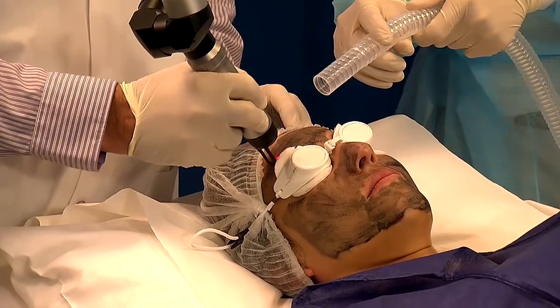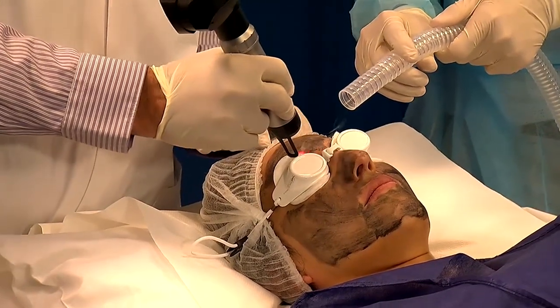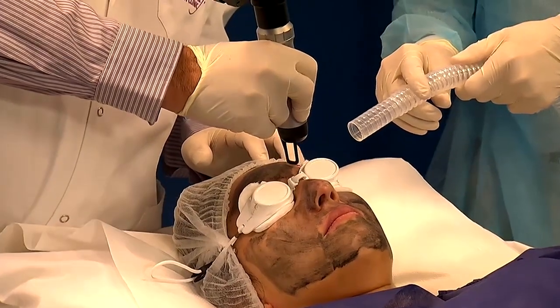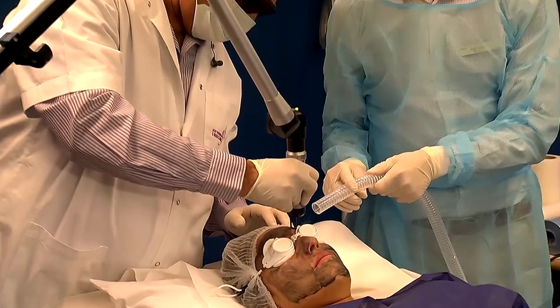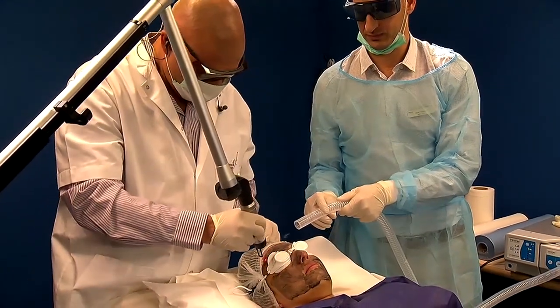After that, we have a drier layer, and then the skin will be removed faster and easier. It's a procedure that doesn't cause any pain or discomfort to the patient. It has almost instant results. There's no downtime.